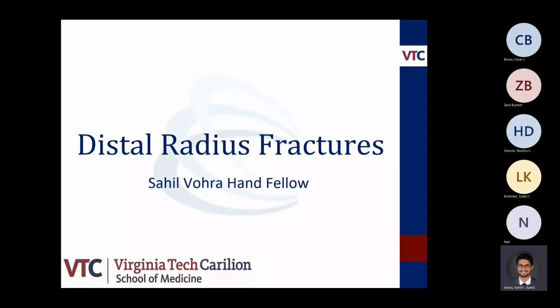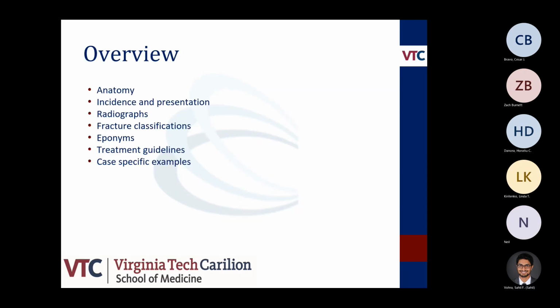Talk about distal radius fractures. And basically an overview of what I'll talk about briefly: we'll go over the anatomy, a little on the incidence and presentation that you may see in the ER. We'll go over some radiographs and then fracture classifications, some of the eponyms, and then treatment guidelines as we have them now. And then we'll go through some case-specific examples.